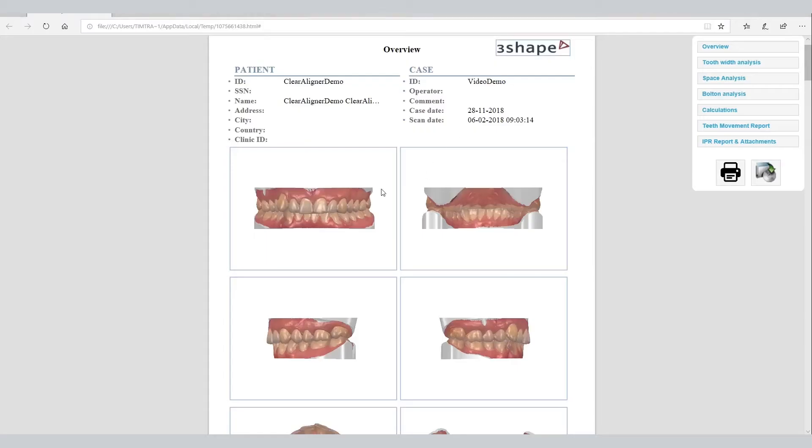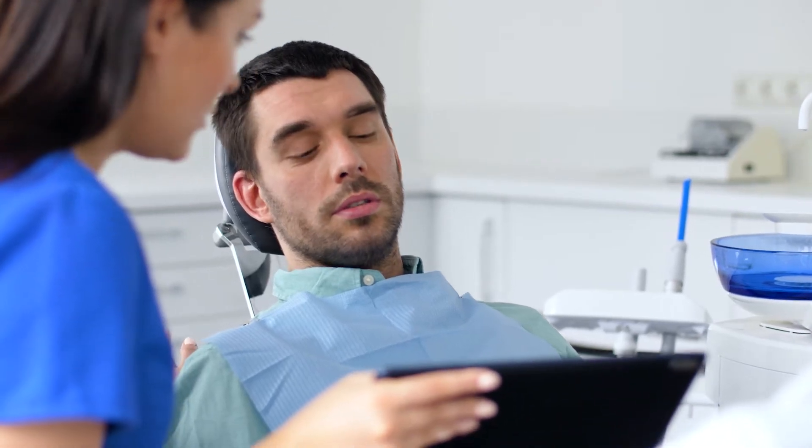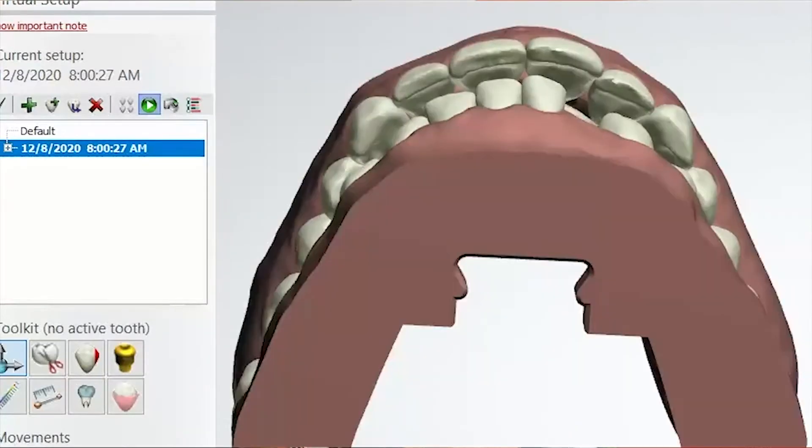Using state-of-the-art aligner software, a 3D treatment plan is generated simulating the teeth movement in small increments. This plan shows the proposed number of stages and the placement of any attachments that will be used. The plan is then electronically sent to the clinician for review.